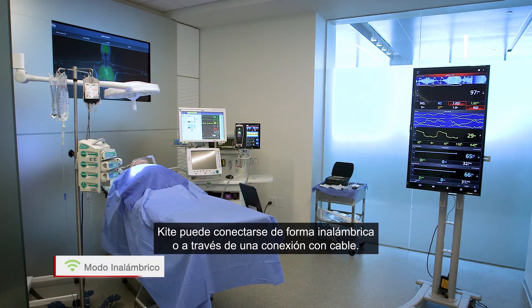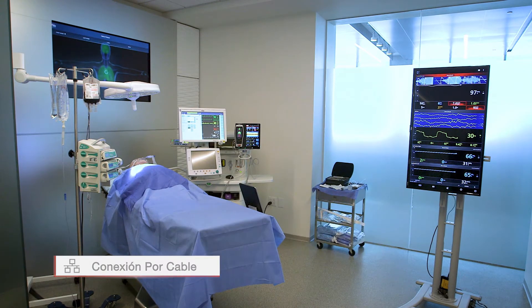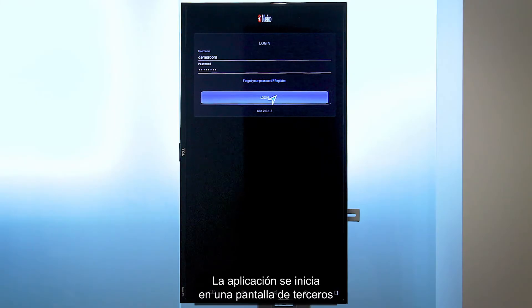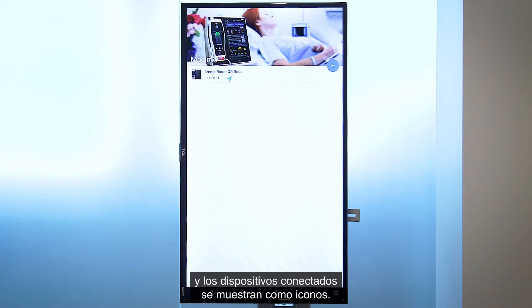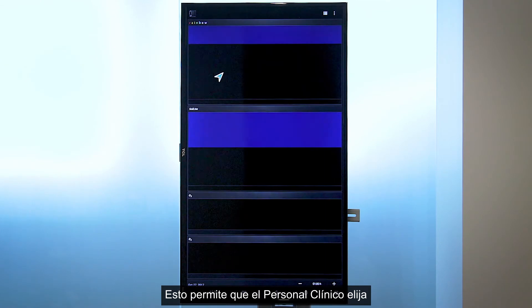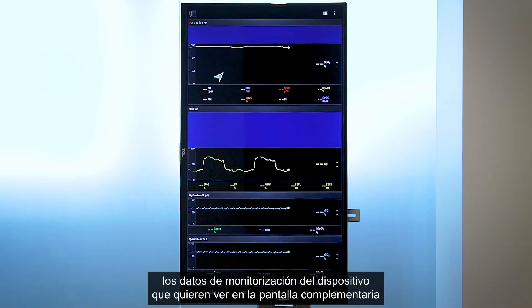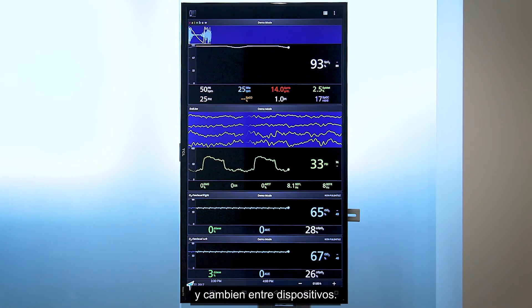Kite can connect wirelessly or through a wired connection. The application is launched on a third-party display screen and connected devices are shown as icons. This allows clinicians to choose which device's monitoring data to view on the supplemental display and to toggle among devices.